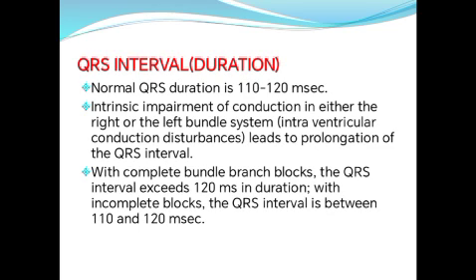If it is an incomplete right bundle branch block or incomplete left bundle branch block, the interval will be less than 120 milliseconds, from 110 to 120 milliseconds. Okay.